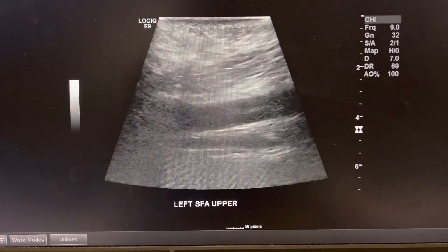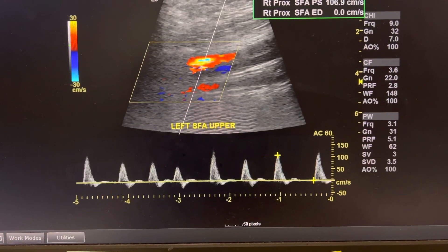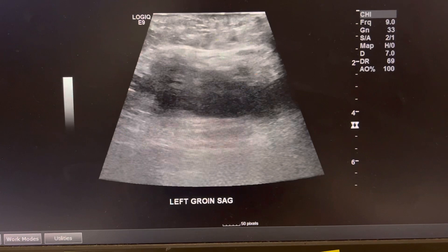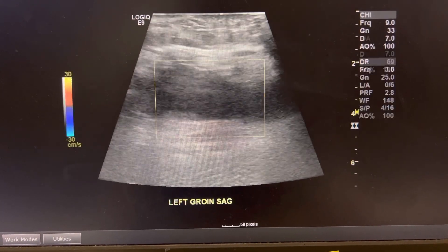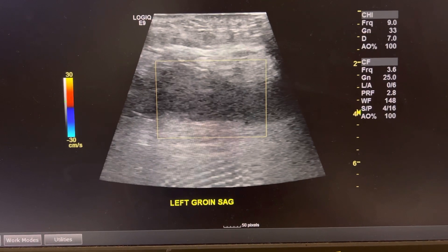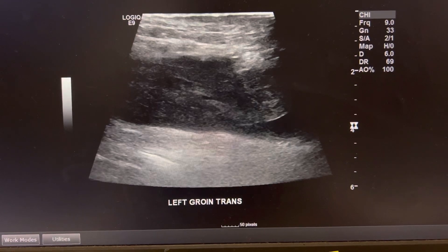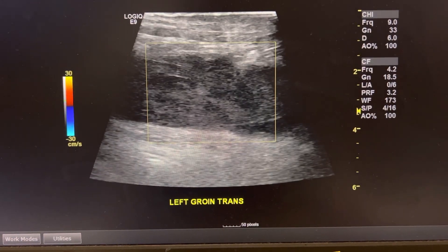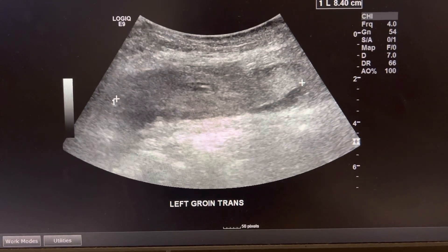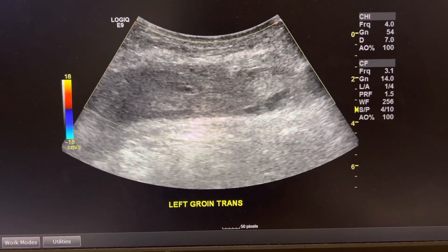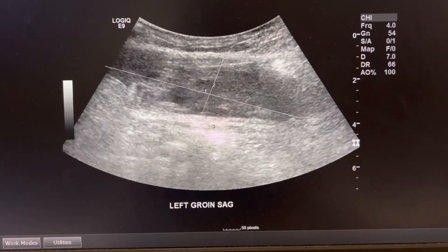I'm going to show you the pseudoaneurysm that I found. At first it was really hard to see in the left groin area because of all the swelling and the bruising. After I did all my scans with the linear probe, I changed to a curved probe. You can see here that I saw the hematoma this patient had in their left groin, and I decided to change to the curved probe to get a better picture of it.